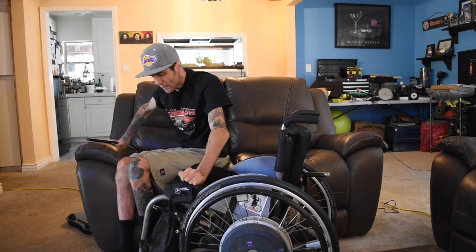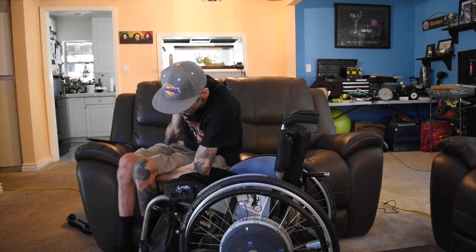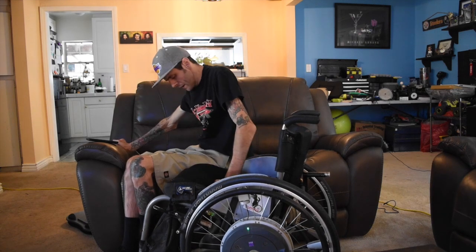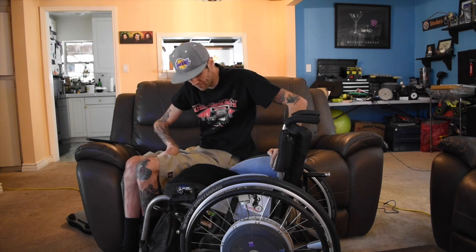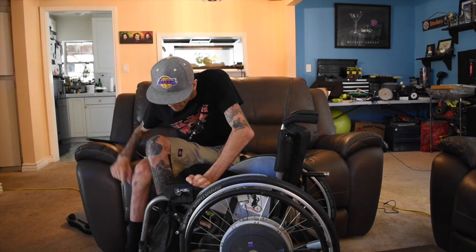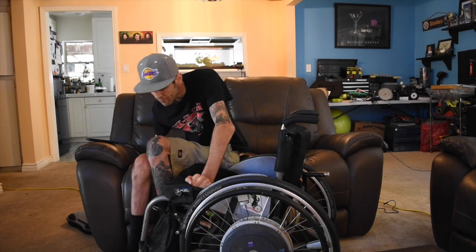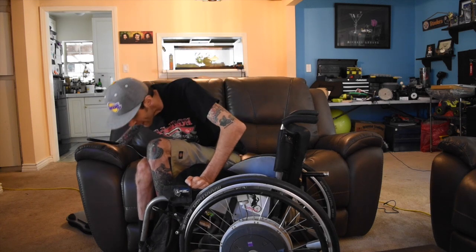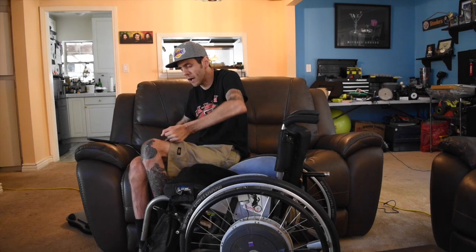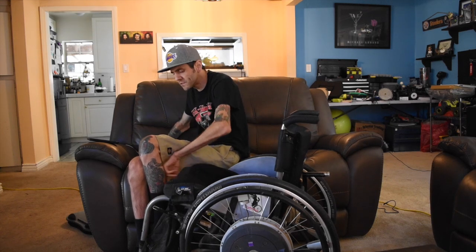Get to the end. Now I go to the elbow, and I can do a little extra scoot. Get right up to my transfer point. Now I put my foot on the footrest. Same thing, I got my heel back and then my toes sticking out of the front of the footrest at an angle. And that helps for when, whoops, it's bouncing.